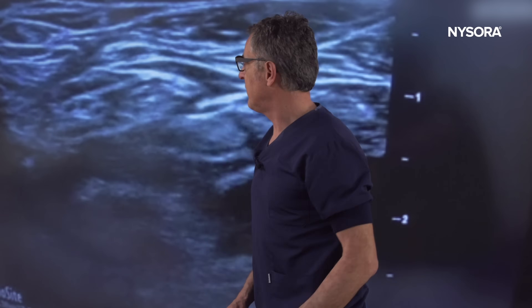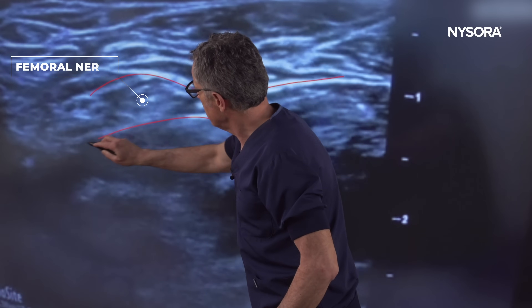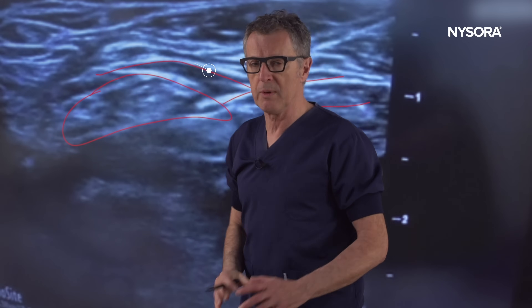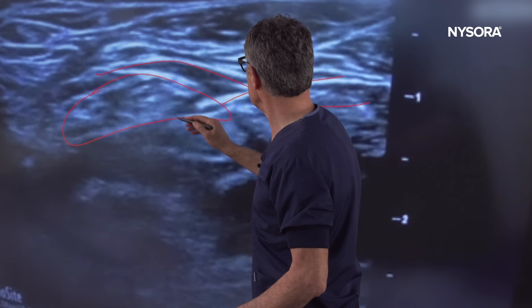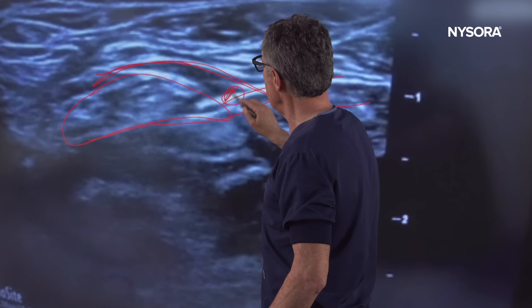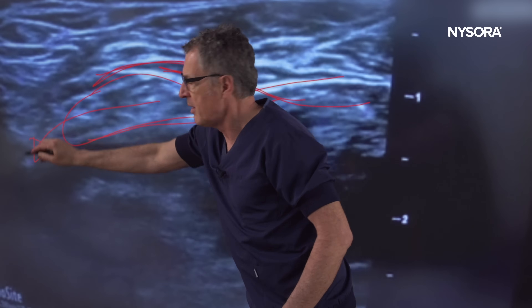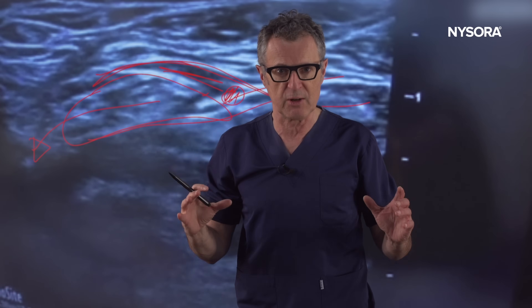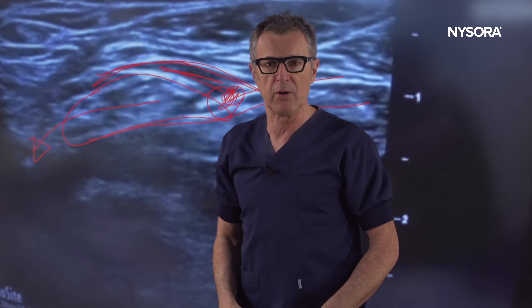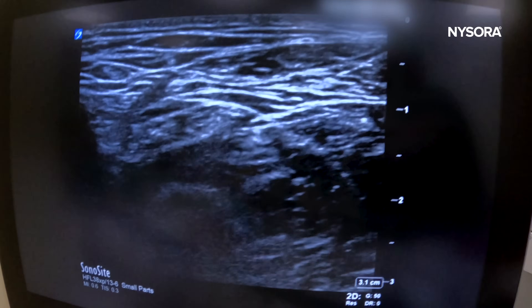Let's briefly discuss the anatomy. That's the needle, that's the femoral nerve, and that's the fascia iliaca. With the femoral nerve block, all we want to do is place the needle between the two layers of fascia iliaca and inject local anesthetic that pushes the nerve away. It goes into the corner of the femoral nerve sheath.